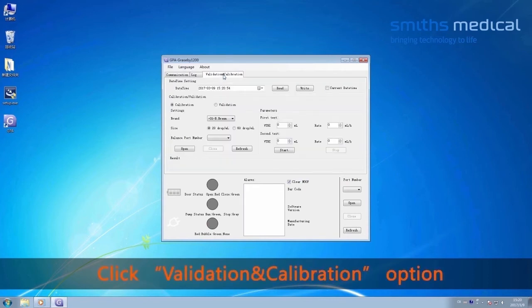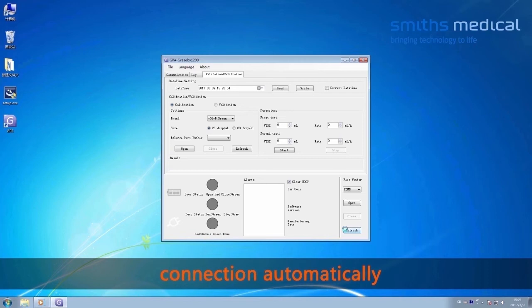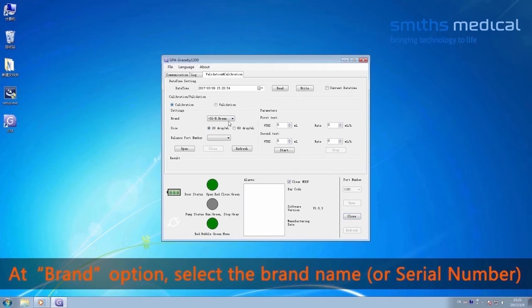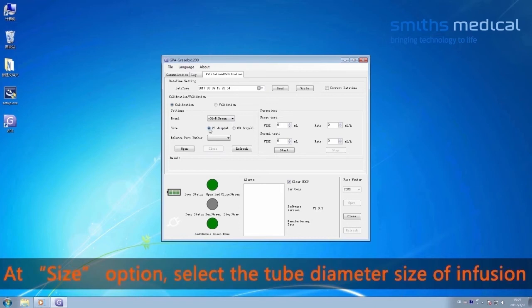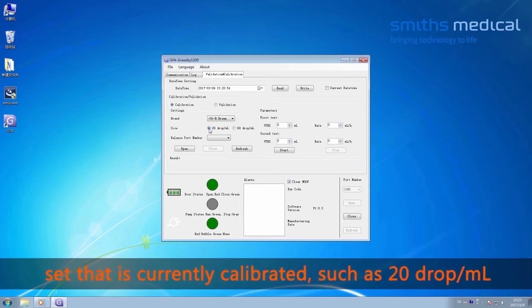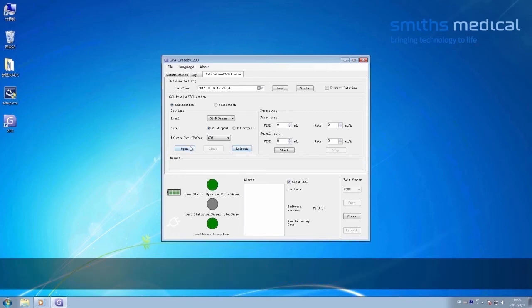Click the Validation and Calibration option. Click Refresh — the system auto-detects the port number of the pump connection. Click Open. Select Calibration. At the brand option, set the brand name of the infusion set that needs calibration, such as B. Braun. At the size option, select the tube diameter of the correctly calibrated infusion set, such as 20 drops per mL. Click Refresh to auto-detect the port number of the balance connection, then click Open.